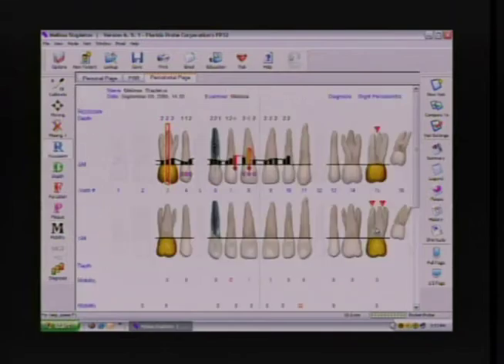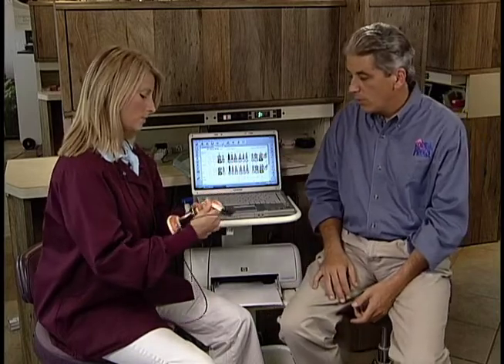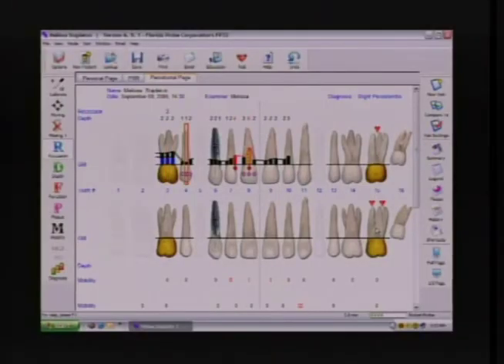Upper arch. Recession. Excellent. On our patient, our first significant recession is where? Number 3. Okay, so let's measure 3. We insert the tip, contact the margin, step once, CEJ, step again. 3. Okay, and it advanced to 4. Recession on 4, measure it. 2. Excellent. Let's advance over to 11. Quick taps advance and record a 0. And let's measure that big one on 11.